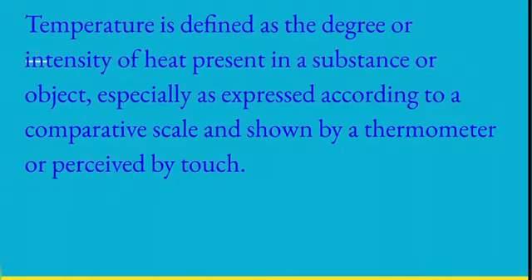Hello everyone, today I'm going to be showing you how to measure an oral, axillary and temporal temperature. Temperature is defined as the degree or intensity of heat present in a substance or object, especially as expressed according to a comparative scale and shown by a thermometer or perceived by touch.